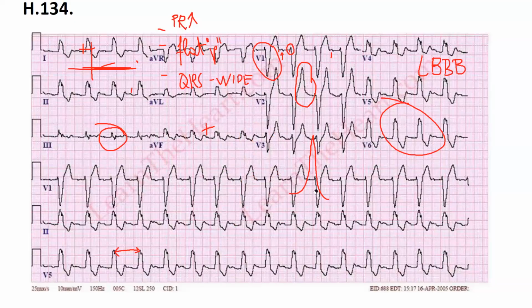What does it indicate? Hyperkalemia. Now, this is another very important point of the ECG.